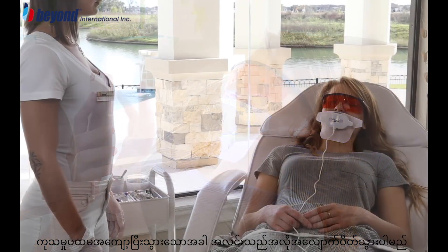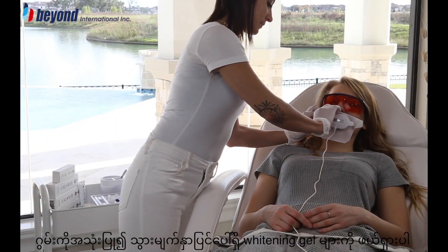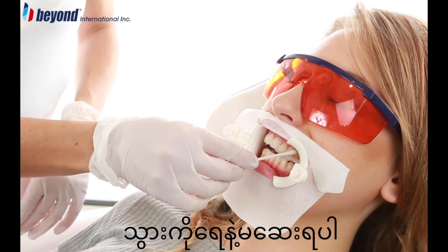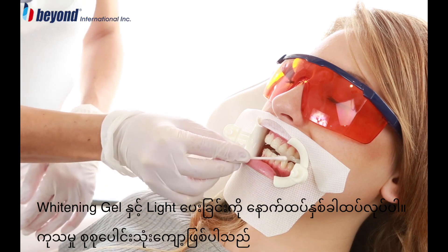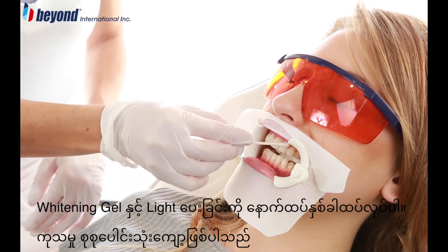At the end of the first cycle, the light will turn off automatically. Wipe off the whitening gel from the surface of the client's teeth by cotton swab. Do not rinse the teeth with water. Repeat the gel and light application steps two more times for a total of three treatment cycles.